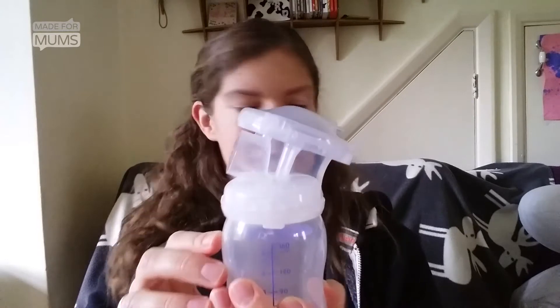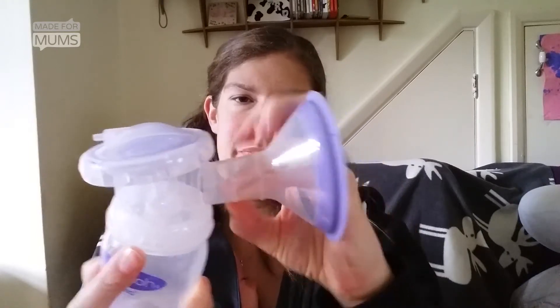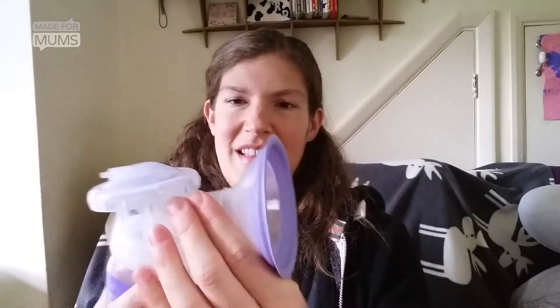Then you get your bottle and screw it to the bottom of the breast cushion body like that, and then all that remains is to put the breast cushion itself in the hole at the top here. As you can hear, he's eager for a feed, so I'll crack on.